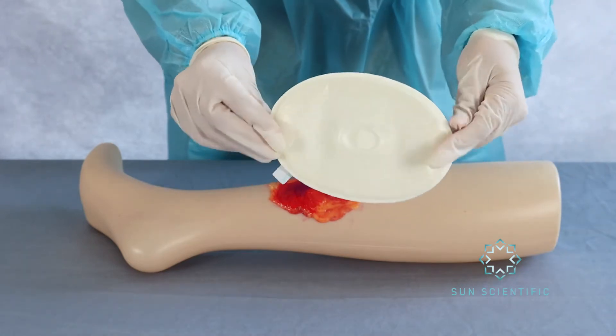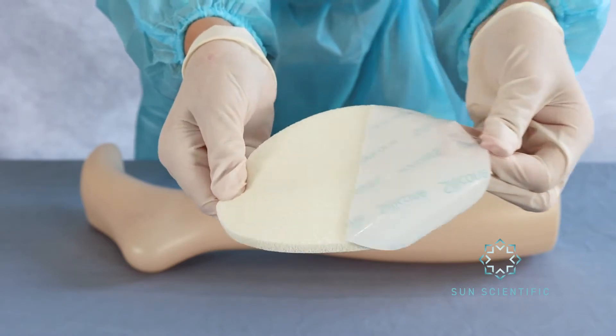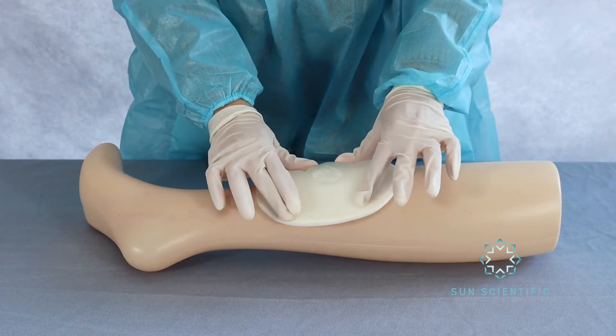Here is a large PFAB — it is oval shaped. Peel back the protective strip, revealing the silicone adhesive face, which is then ready to be placed over the wound. Proceed with care.